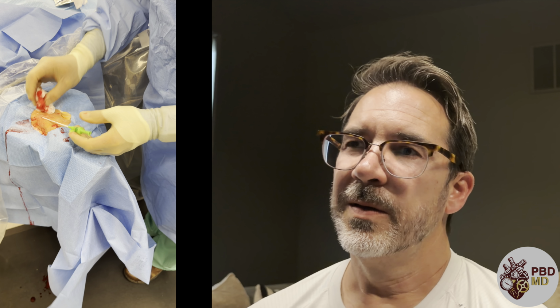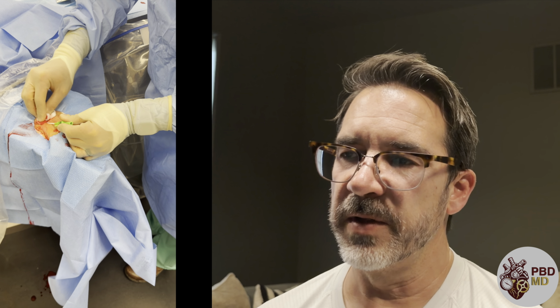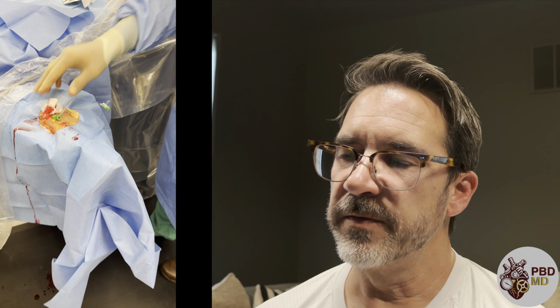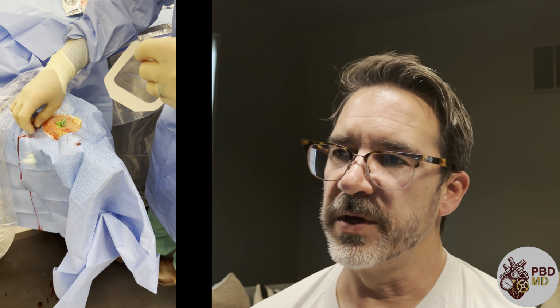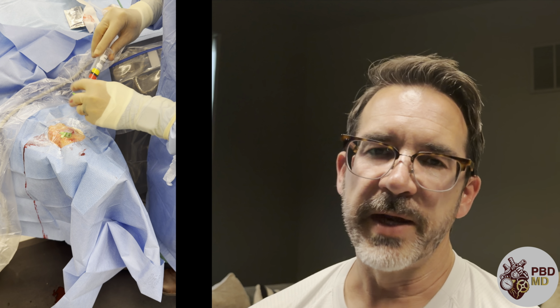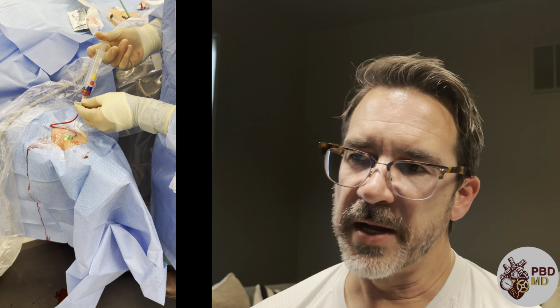One of the very rare complications of this procedure is that the vessel clamps down on the sheath and it needs surgical removal. Fortunately, knock wood, I've never had that happen. In addition to having the hydrophilic sheath, we also use this cocktail that I'm about to give, which has blood thinner, heparin, and then some vasodilators, nitroglycerin, and verapamil. And these just kind of relax the vessel as much as possible and keep it from clotting off.